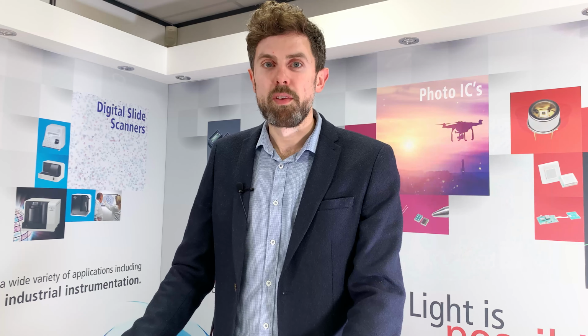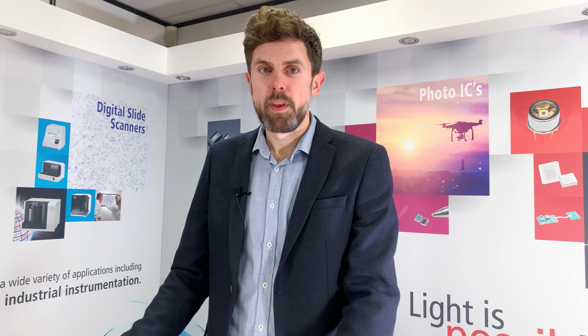The traditional photomultiplier tube has been used in medical diagnostic, medical imaging and the analytical instrumentation sectors for decades, and the technology still stands as the gold standard for low light detection. The silicon photomultiplier can be considered as a semiconductor alternative to the traditional photomultiplier, with particular advantages in terms of cost, scalability and certain performance characteristics.